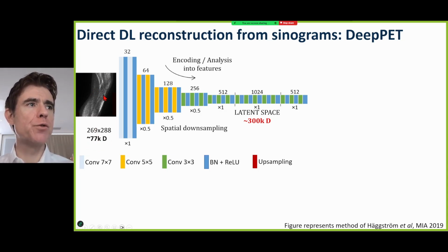They run this through downsampling-based convolutional layers, effectively to encode that into what we call a latent space representation. Now, I find there are a lot of misunderstandings here, possibly even from myself years back as well, that this latent space, this bottleneck, isn't necessarily, as in a conventional autoencoder, a low-dimensional representation.